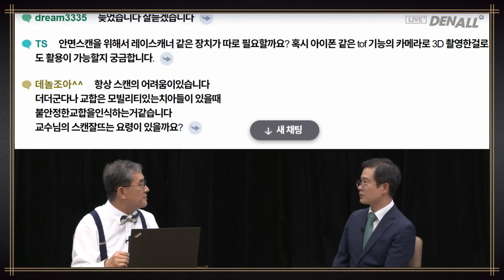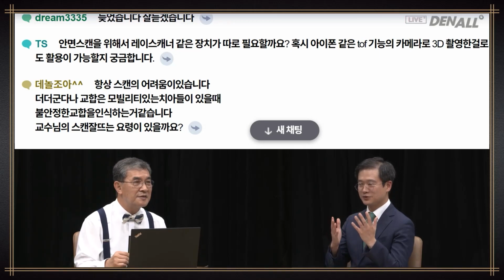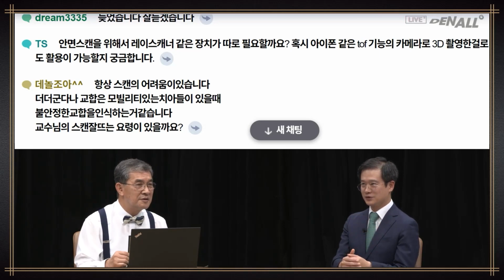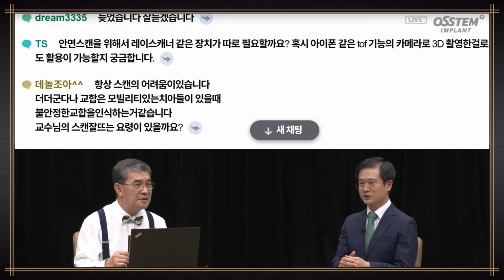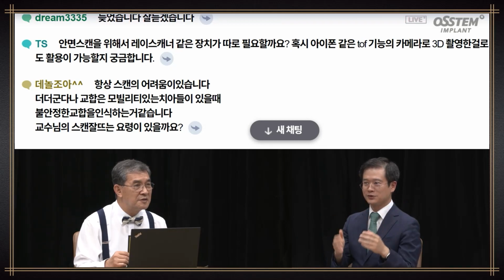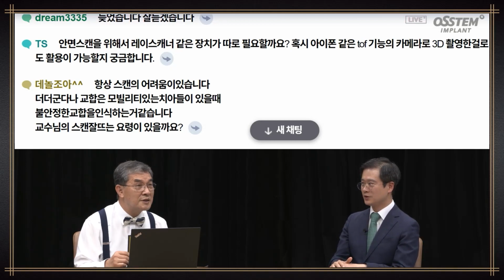When I first attempted facial scans, I used depth camera in iPhone. The images you get with these kind of devices, the resolution of 3D data is a little bit low, but you add the image and you can get nice results. You can get beautiful results. iPhone is good, but you need to have the patient bite on the bite scan jig, or else there can be distortions on the tooth.